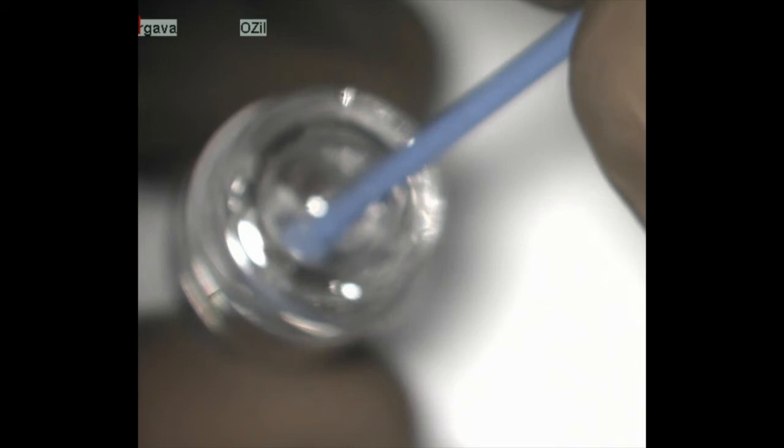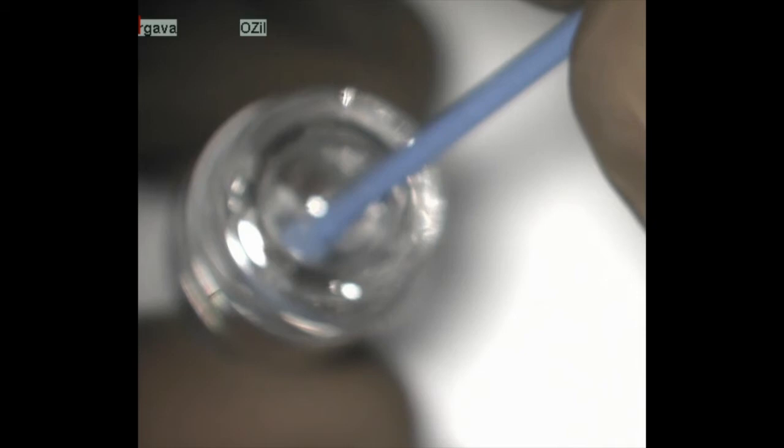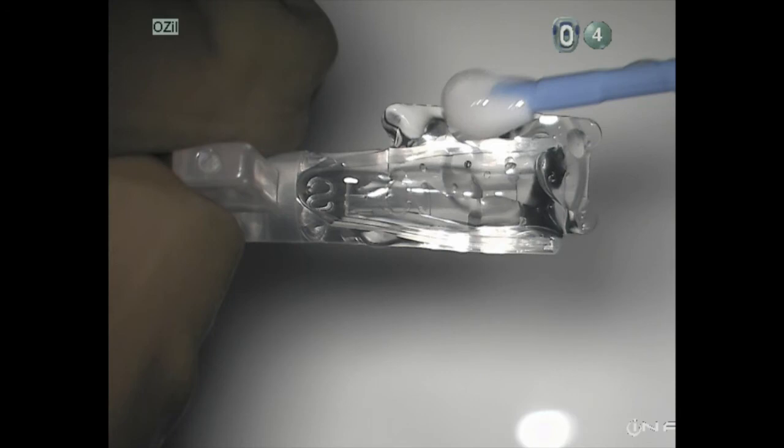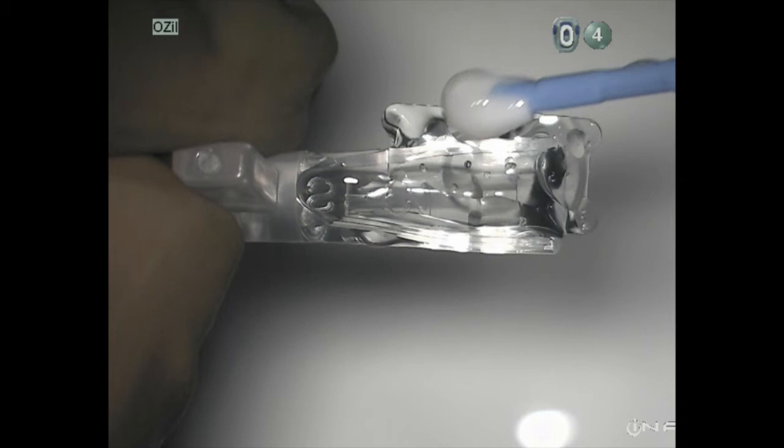To show some steps of the surgery: the lens comes in a bottle and is picked up with a cotton-tipped applicator. It is so delicate that it cannot be handled with forceps. It is then inserted into a cartridge, and that cartridge is placed on an injector, making the lens ready to be introduced into the eye.